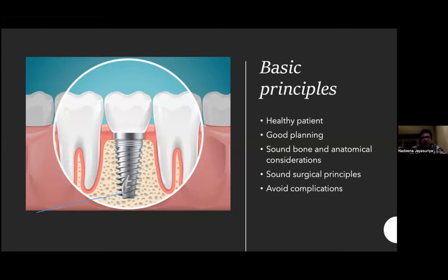And you need to assess the bone, obviously. Implant goes into the bone, so you need to find out the good bone.